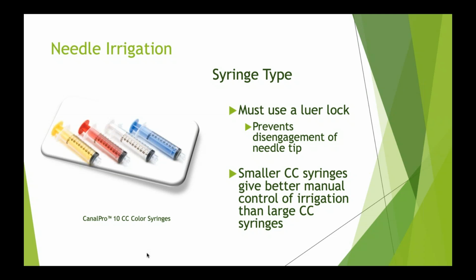I personally like the smaller ones. I use the 5 cc's. It just fits better in my hand. It's easier to express, but that's just a personal preference. You might have some clinician that's got big old mitts, and they may want the 10 cc's. That's fine. Just whatever works best in your hands.